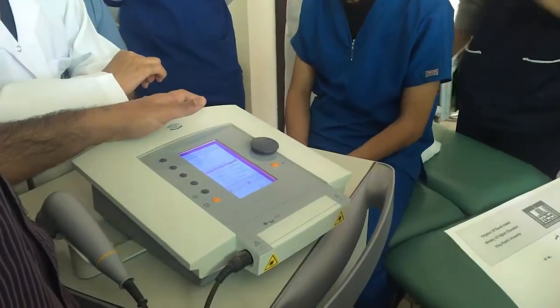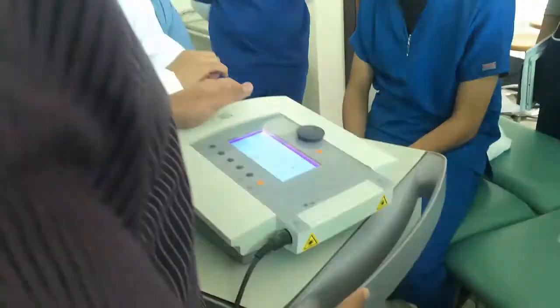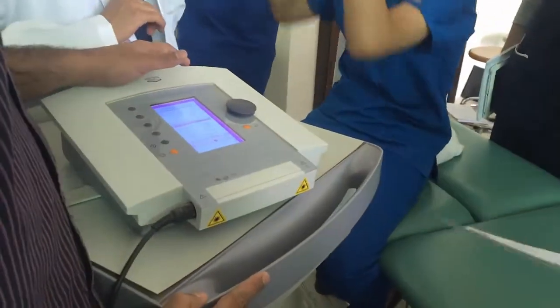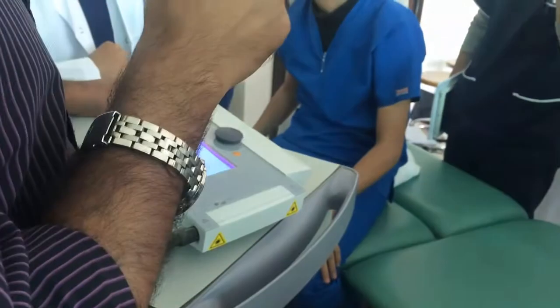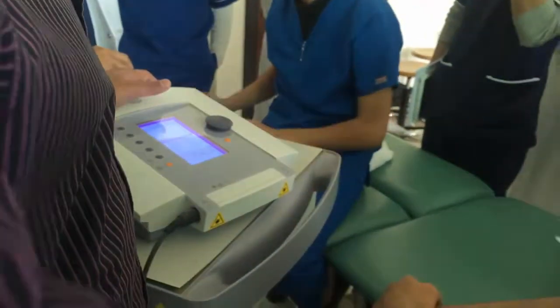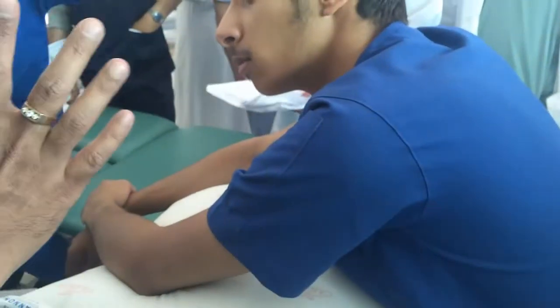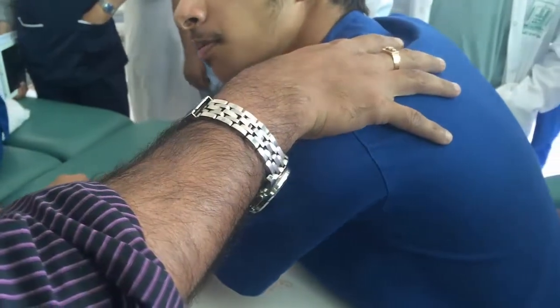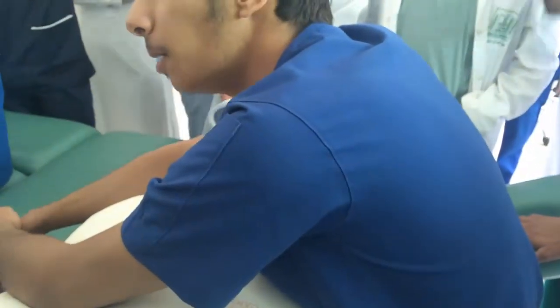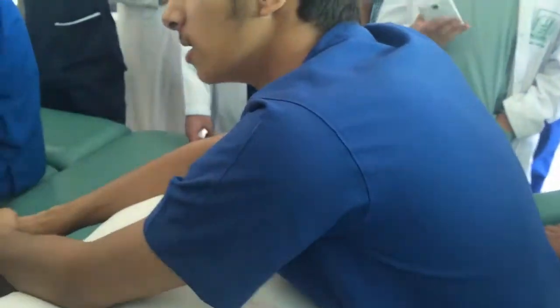But say for the technique, what is the... Why do you want more? Practical, I'll ask you different. Your patient is having neck pain, back pain, shoulder pain, elbow pain, knee pain, everywhere pain. Give laser. Understood? You have to position. Any joint, anywhere pain, 1 minute. Not all 1 minute, depending upon the dosage.